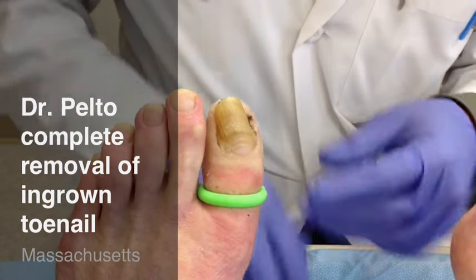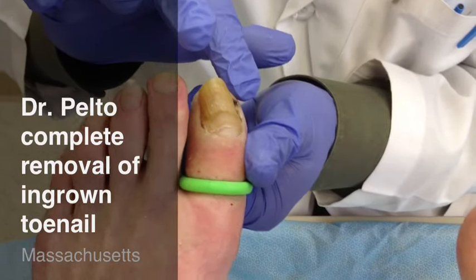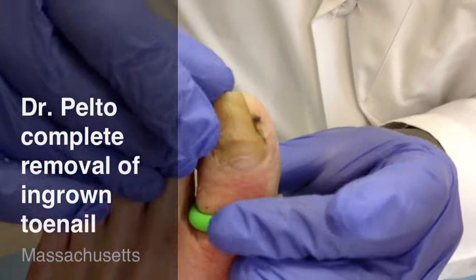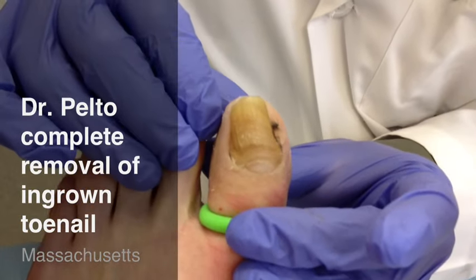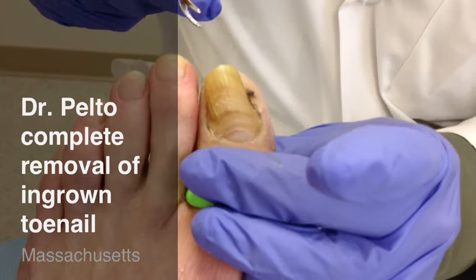A total nail avulsion is different than a partial. Usually with a partial, we take out one little edge of the toenail to relieve an ingrown toenail. But if you notice this nail, it can be lifted up — it's almost already off anyway. So for this type of nail, where it was infected and painful, it's just easier to remove the whole nail. And that's what we're going to do today.